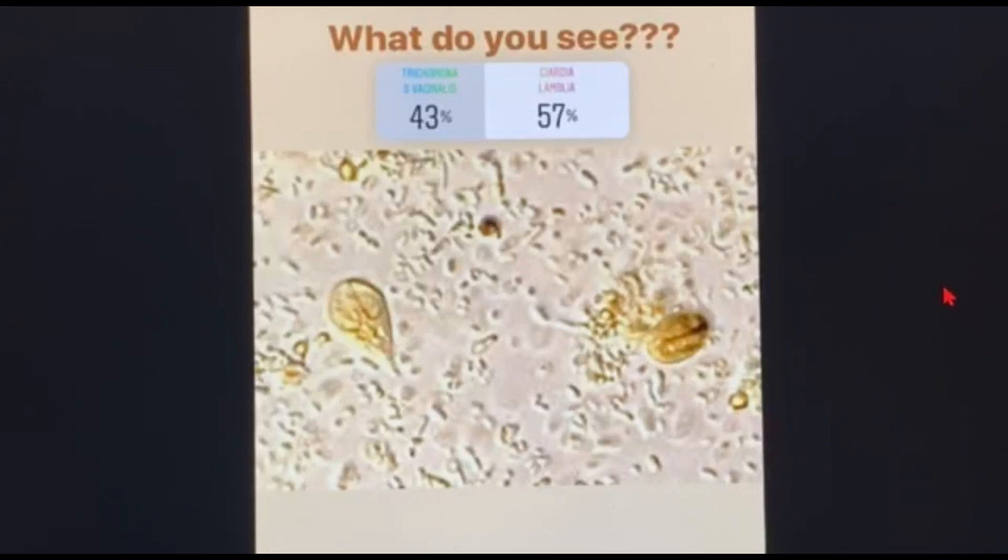Hello friends, we meet today again for yet another differentiation in spotters. This is between two protozoans. Now it is not that difficult to differentiate between a Trichomonas vaginalis and Giardia lamblia.